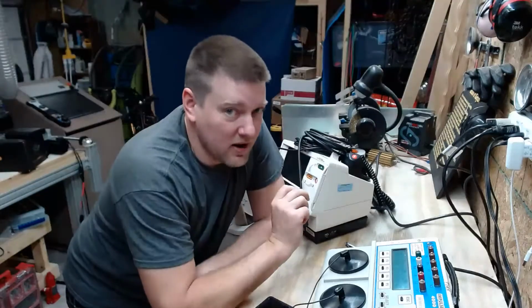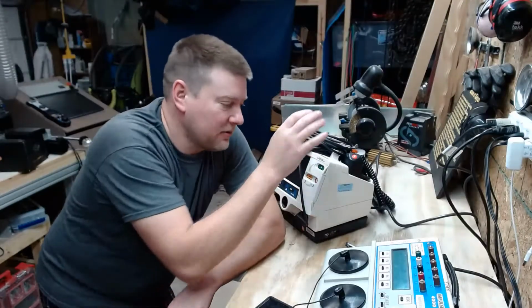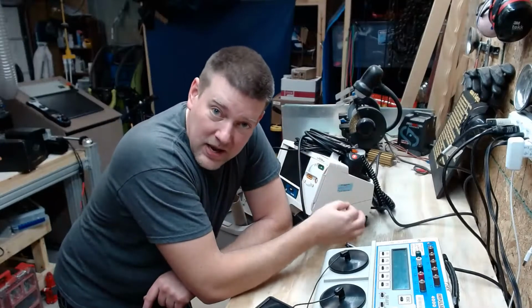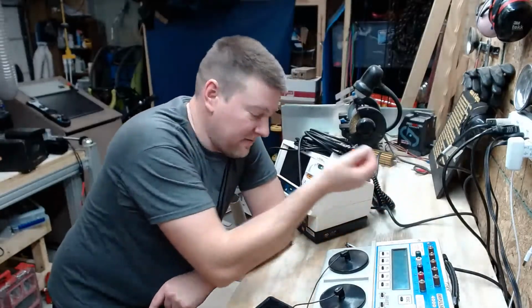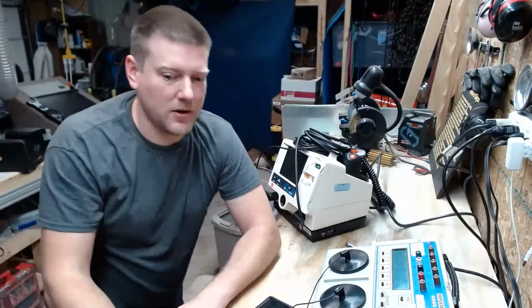It was also an item on my checklist, the very bottom one after printer door, cable stowed, plugged into a red outlet: is the PM sticker installed. And at that time you'd pull it off the speaker, stick it on the side where it normally belongs, and you're good.